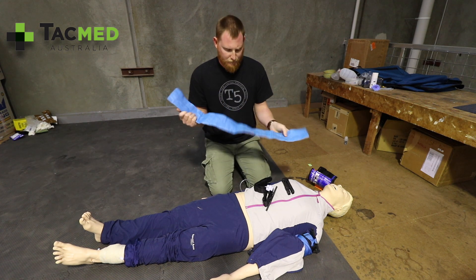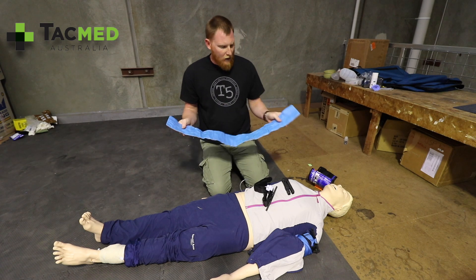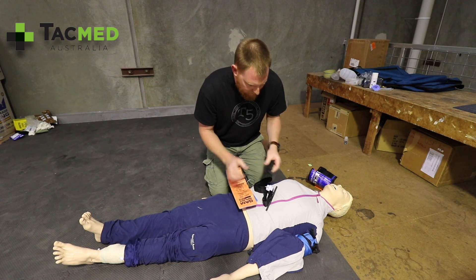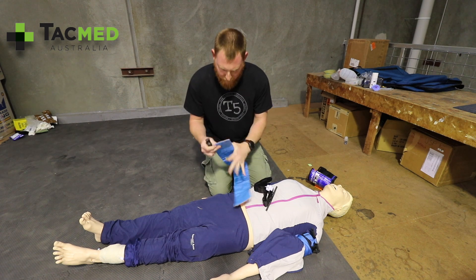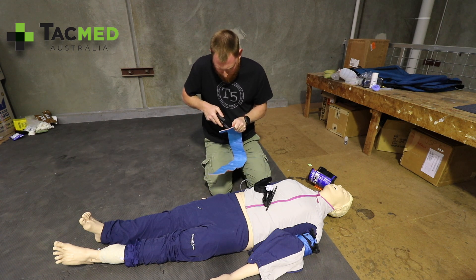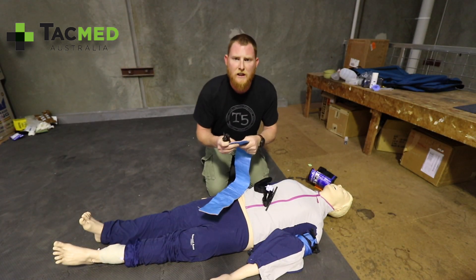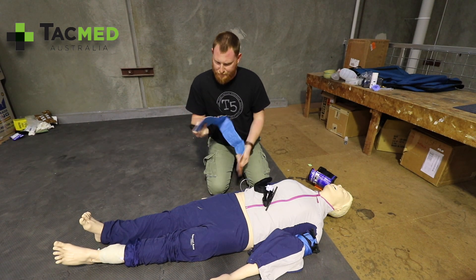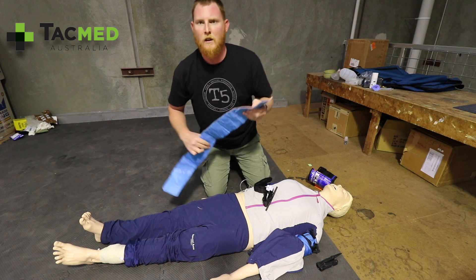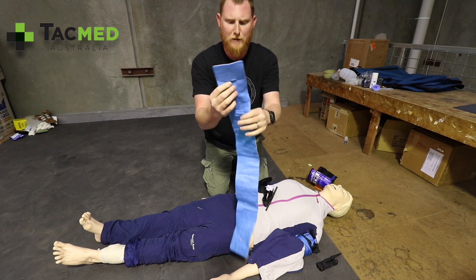Get your SAM Splint out and open it up. For a normal-sized adult — Resusci Anne here is quite small — we generally make cuts quite close to the edges. For Resusci Anne, I'll make the cuts a bit shorter. Being careful not to cut your patient or yourself, just place a couple of cuts in there. The cuts need to be wide enough to fit your CAT Tourniquet through, and again on the other side. I've now made two cuts in either end of my SAM Splint.